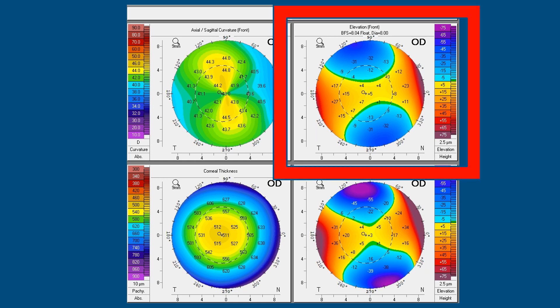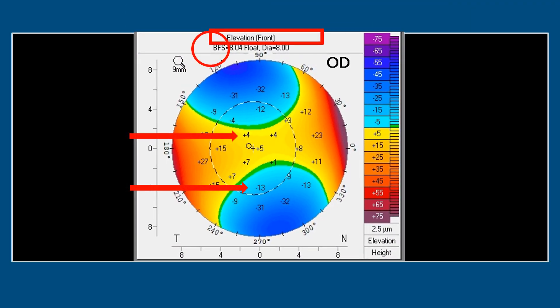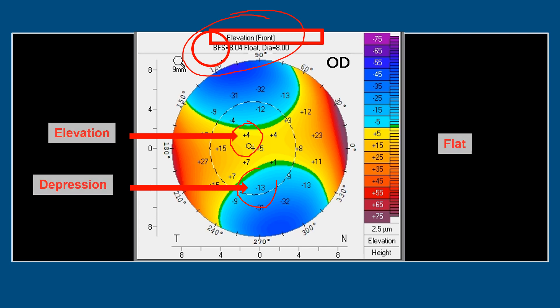The anterior elevation map also shows elevation in comparison to the best fit sphere. The plus values indicate elevation — protrusion of the cornea above the best fit sphere — and minus values indicate depression. A value of 0 means the cornea is exactly at the best fit sphere level.